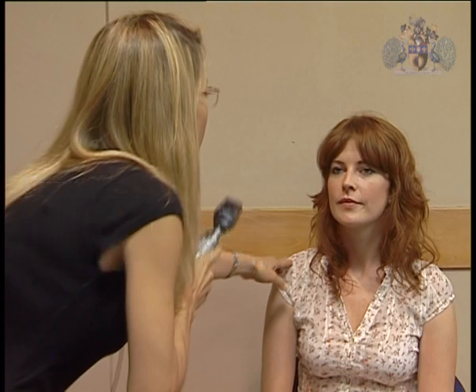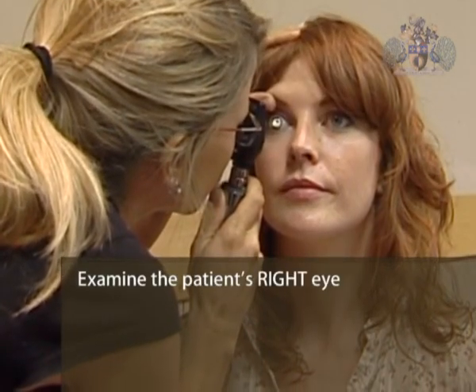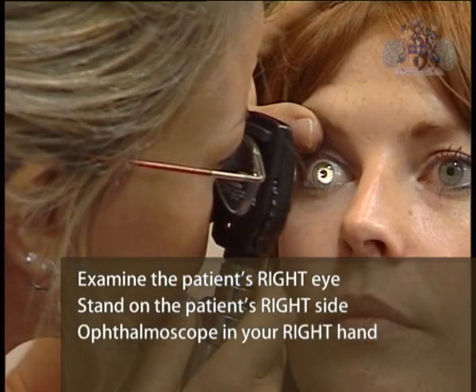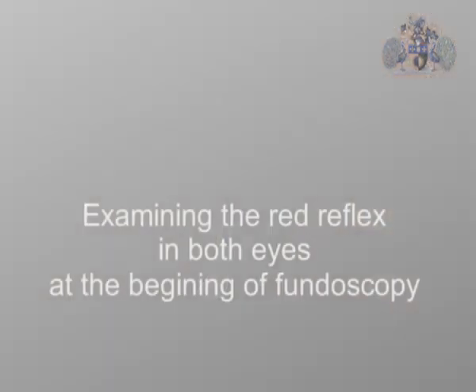Rules for using the ophthalmoscope. Examine the patient's right eye. Stand on the patient's right side, ophthalmoscope in your right hand to your right eye, to the patient's right eye. And please don't look side to side.